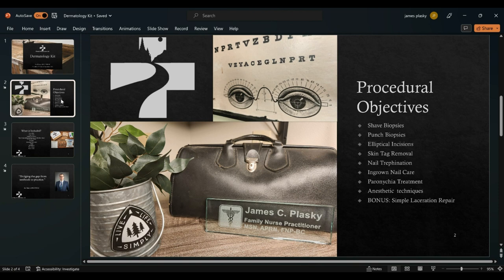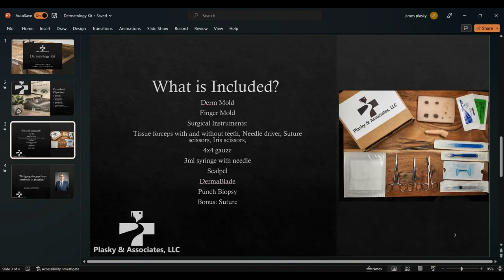In your kit, you'll see the addition of suture and a needle driver included as a bonus package. A photo shows everything included: at top center is that derm mold, which took the longest to create and was a game changer for students. The surgical instruments include tissue forceps, needle driver, suture scissors, and iris scissors — not for patient care as they're not sterile, but great one-and-done instruments you can use at home.